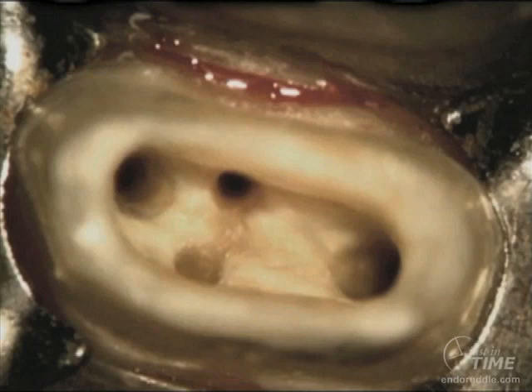We can use again this same analogy as we use in restorative dentistry, and we can take it to our endodontic access preparations. In this analogy, the rhetorical question is, are you able to withdraw a wax pattern out of your access preparation without distorting the wax? To the extent you can begin to remove wax patterns in your mind out of your access cavity, you're going to also confirm that you have straight line access.